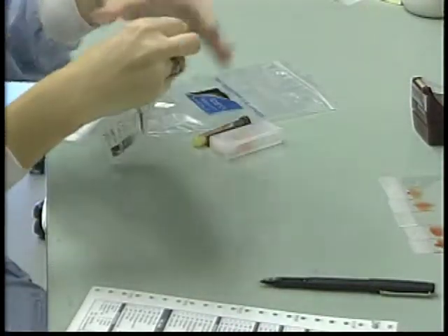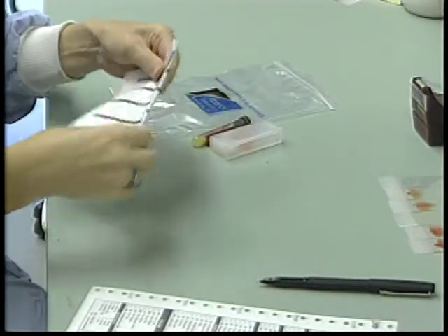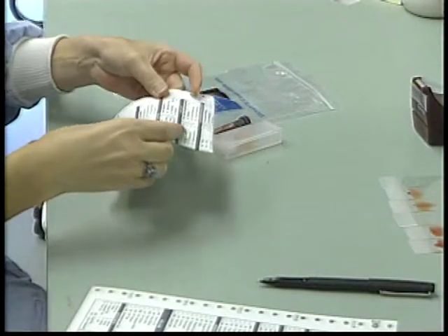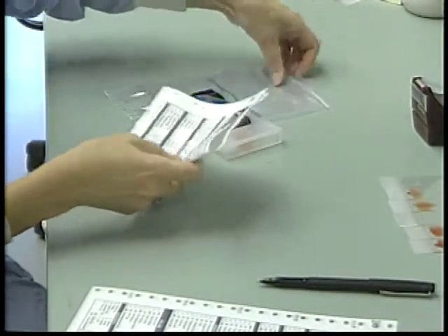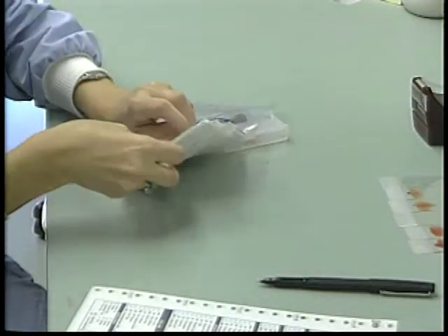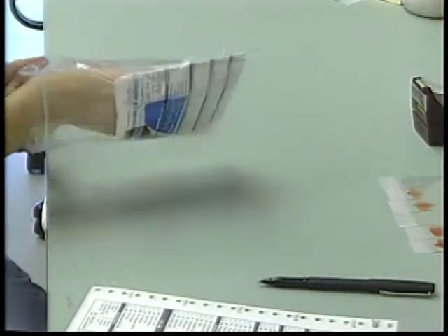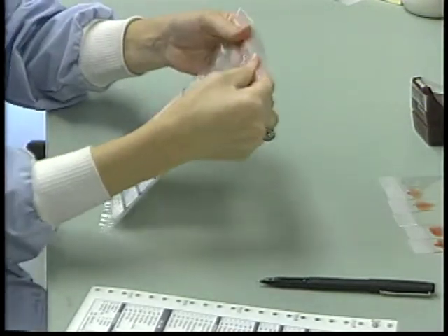When submitting blood to a lab for a CBC, you will need to prepare the appropriate lab form, being sure to include all of the necessary information needed pertaining to the pet, the owner, and the hospital running the test. They will also need a small amount of blood in a lavender top tube, generally 1/2 to 1 cc. They may also request 1 or 2 quality blood smears.